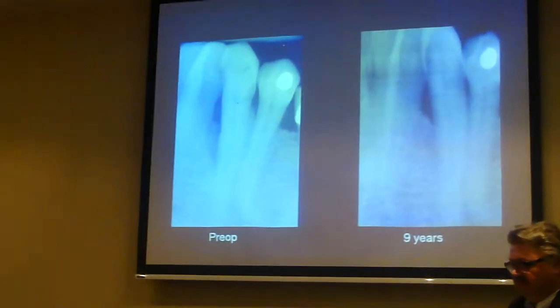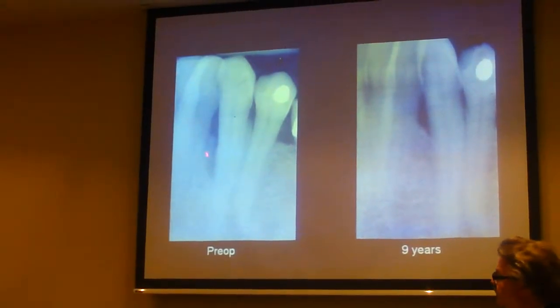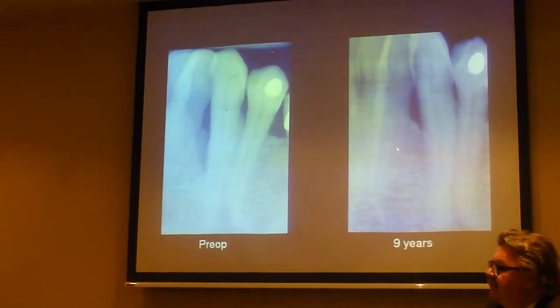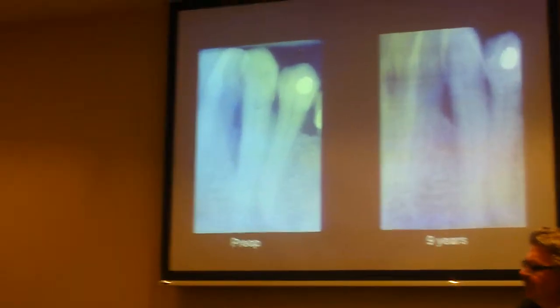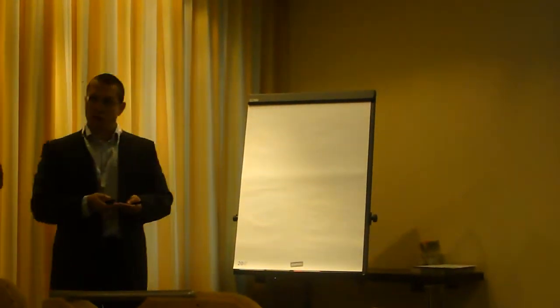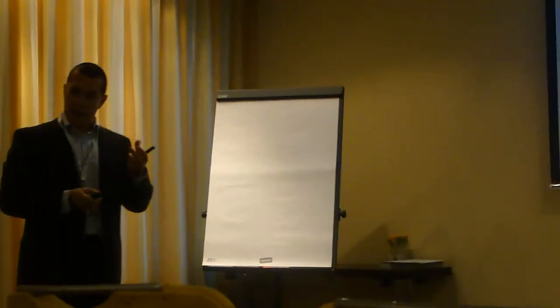And then if you have a look at this X-ray, please have a look at this bone loss. This is the dark spot here. And at 9 years, we have a stable situation, and the entire depth of the intrabony component has been filled with new tissue, with new hard tissue. And that means that we were able to stabilize the situation in this patient, and we have kept the tooth.